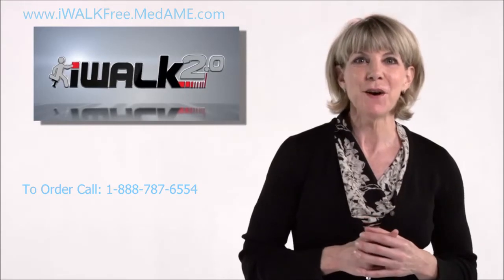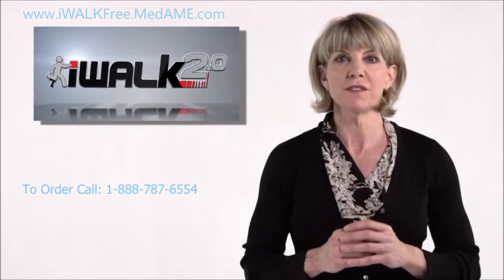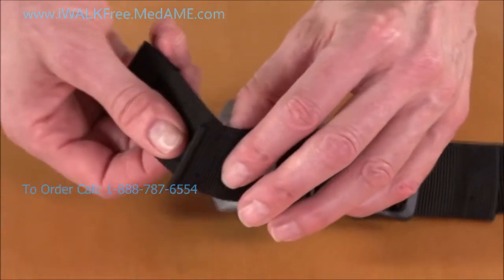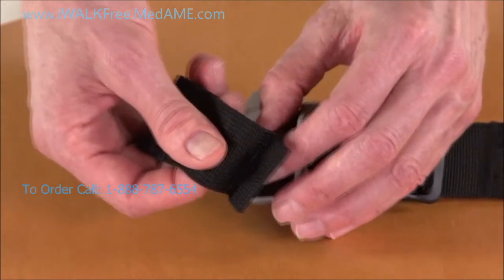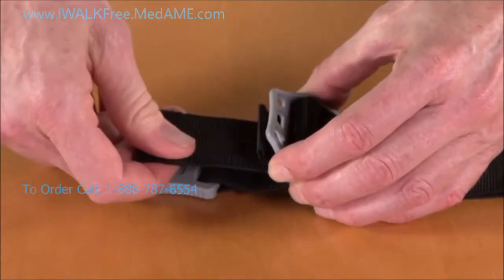By the way, even though the black and grey tension lock buckles look different, they work the same way. While you're doing this, notice that there's a fold that's stitched into the strap. This stops the strap from going all the way through the buckle, to leave enough room so that you can hang on to it.